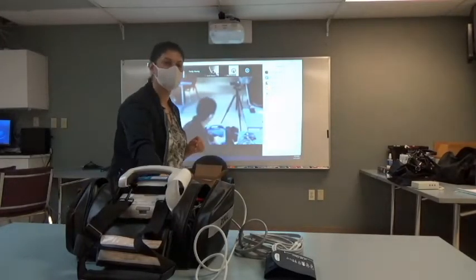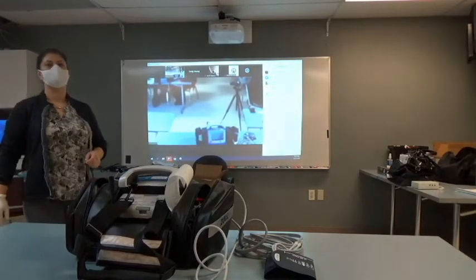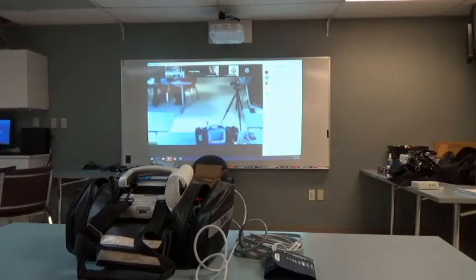At any point, can you add the patient's name and age later on if you want to get a real quick 12 lead and add that later on? You can, I believe, as far as your report goes, but if you're transmitting 12 leads to the hospital, for instance, and that 12 lead that you sent didn't have the name in, it won't show there. When you get to the double screen, stay right there for me, please, so I can show you what you have on your screen.